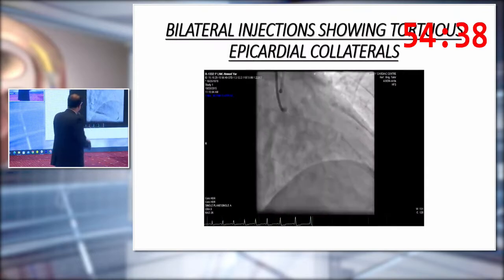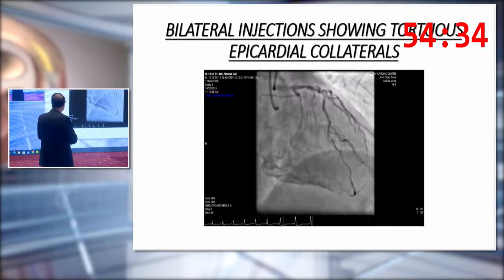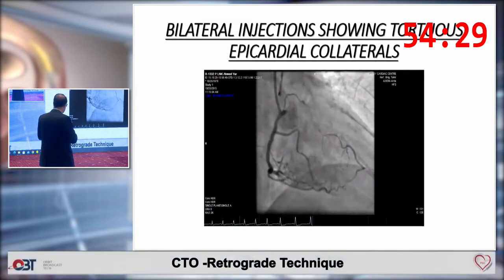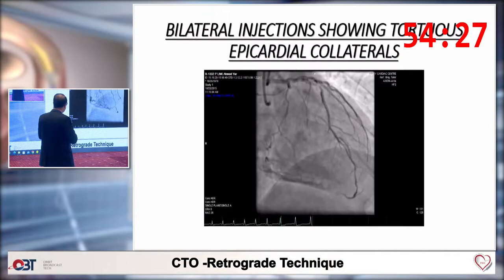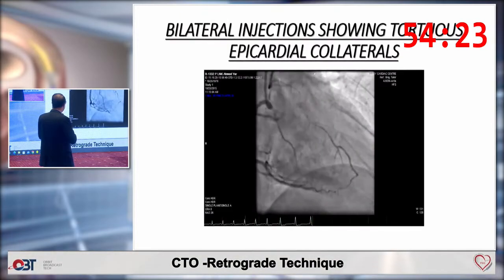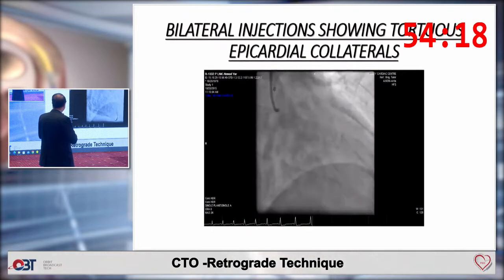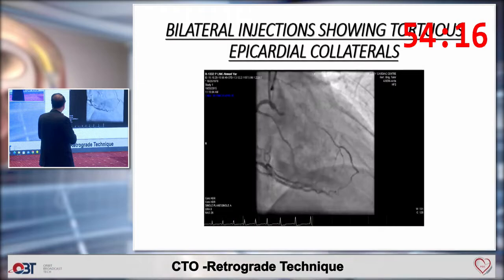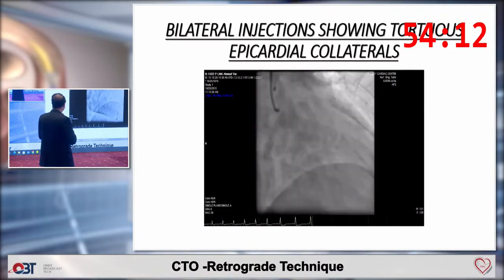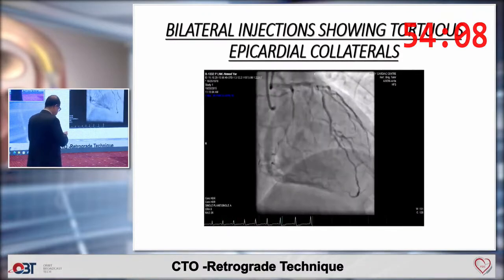So these are the simultaneous injections. You can see an epicardial collateral, quite a tortuous epicardial collateral connecting the right coronary artery to the circumflex. And there is not much segment that is missing. As I already said, ideally an antigrade dissection re-entry would have been quite useful because there's a nice landing zone in the circumflex.